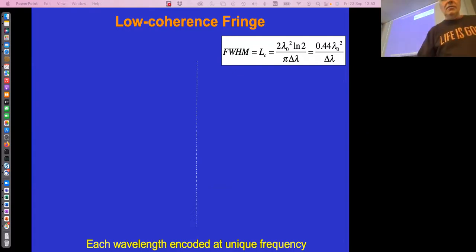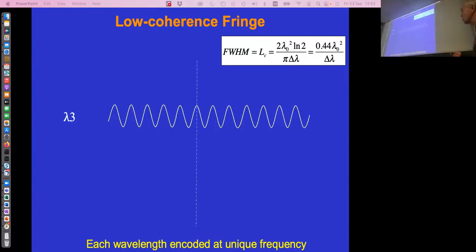So let's start with a laser that sends out a monochromatic wave. This is an output from our Michelson interferometer along this axis of intensity. Here we see the interference pattern when moving the mirror in the reference arm. This point is clear, zero path length difference, we get constructive interference. Then we get here constructive interference. How much have we moved the mirror to reach that point?